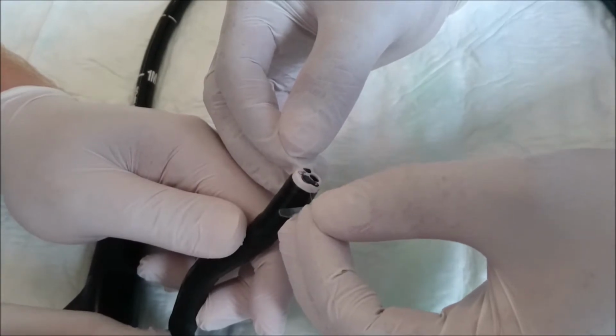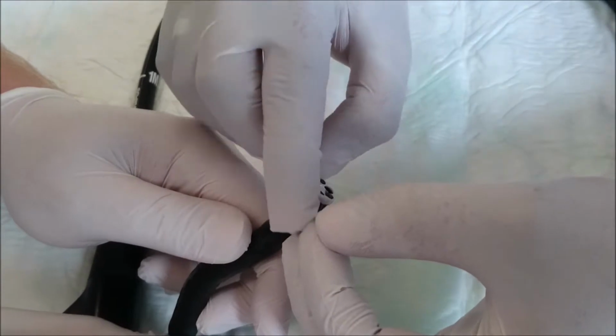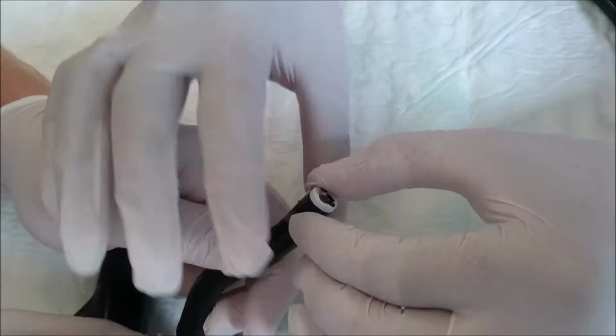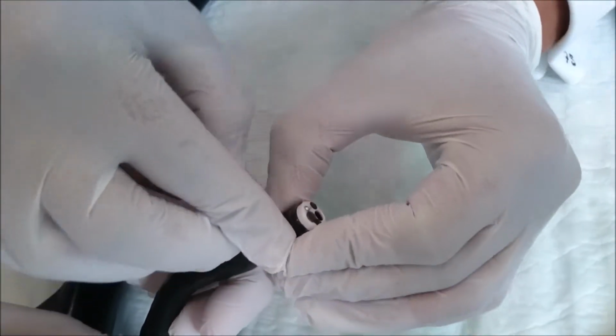The removal of an OTSC from the stomach using what is known as the remove system will be demonstrated here. Before starting, a supplied protective film is attached to the lens at the distal end of the endoscope.